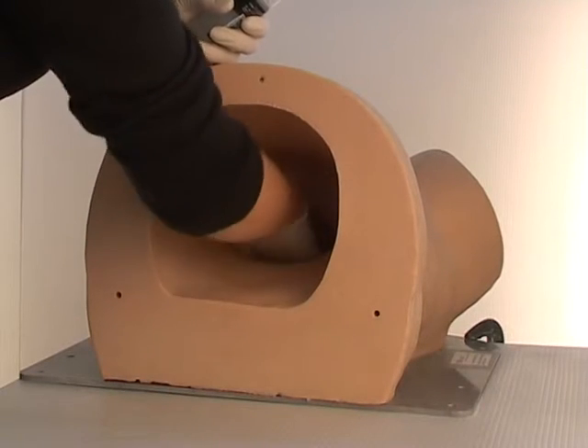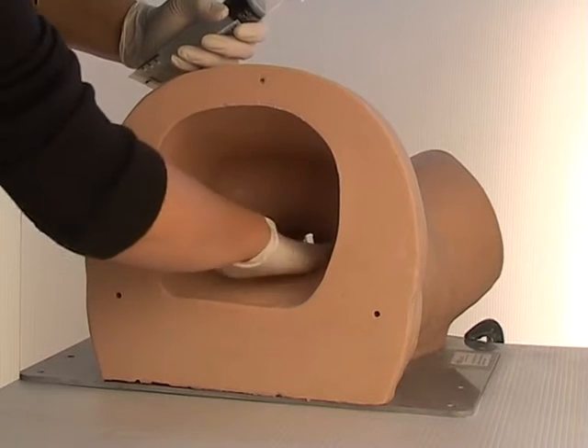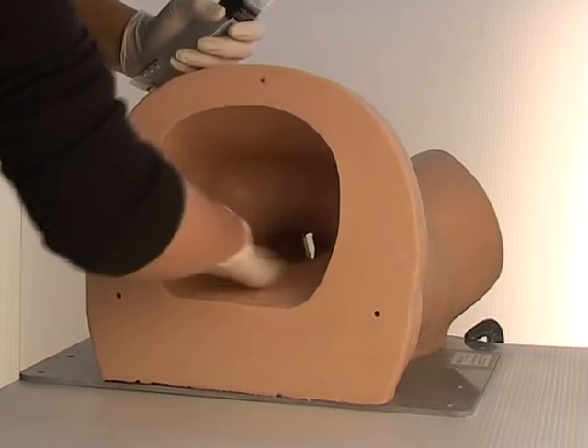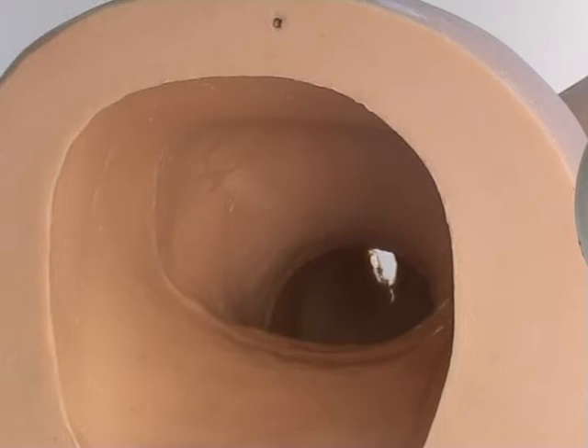Before using Sophie's Mum, make sure she is thoroughly lubricated with a water-based surgical lubricant throughout the entire birth canal. KY Jelly works very well. Please note that ultrasound gel does not work at all and should not be used. One or two squirts of water can help make the inside even more slippery.